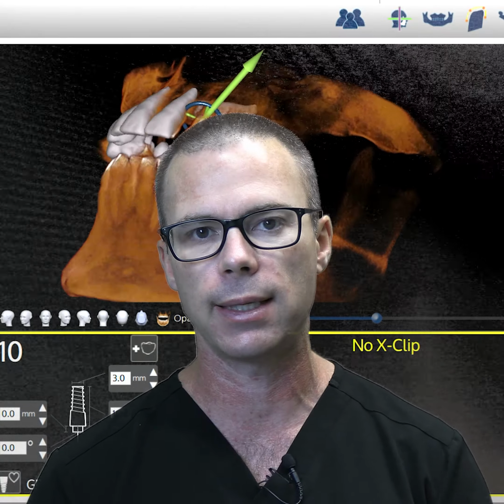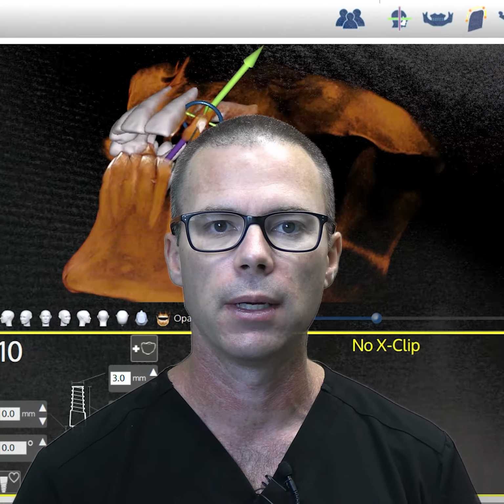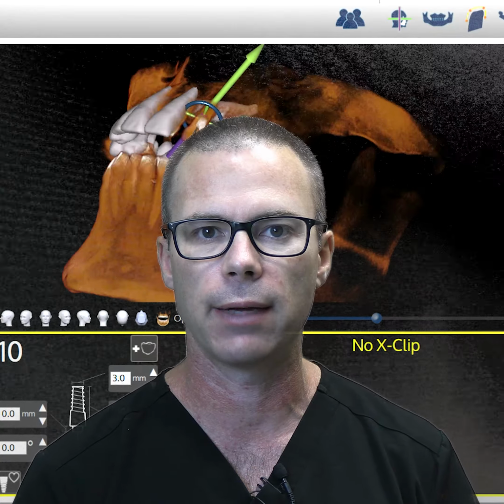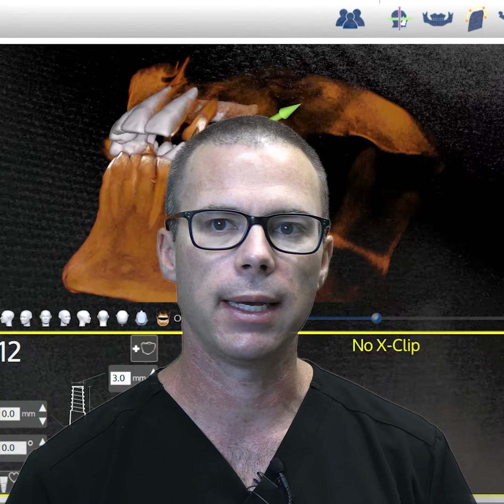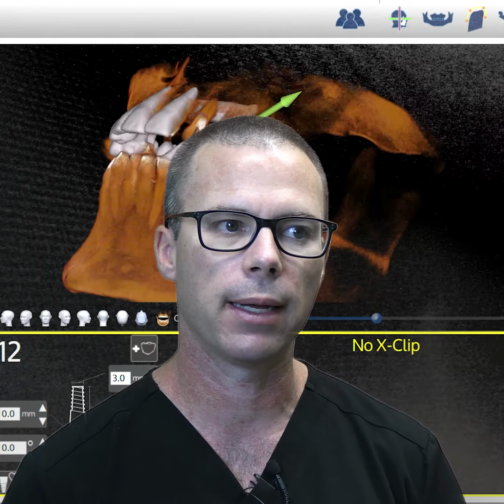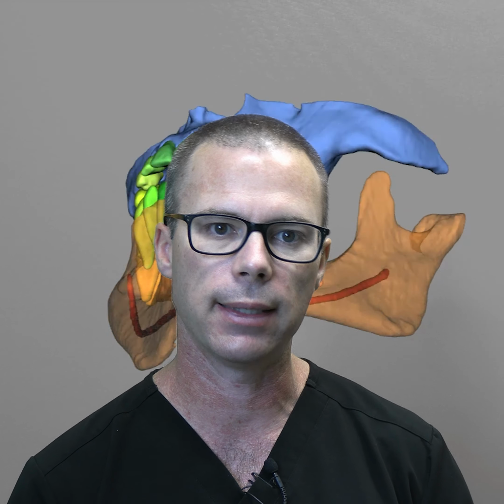So the case that I really wanted to showcase for a number of reasons is a case that I actually performed. It was a dental implant surgery that I performed using the X-Guide dynamic navigation unit. What was unique about this case was the treatment plan called for extracting the lateral and premolar tooth, and as you notice on the segmented scan here, we have an impacted canine tooth.